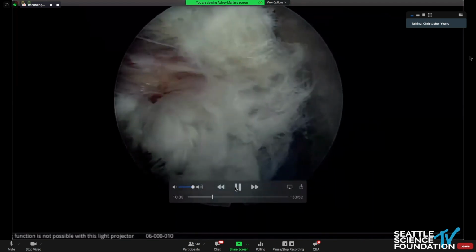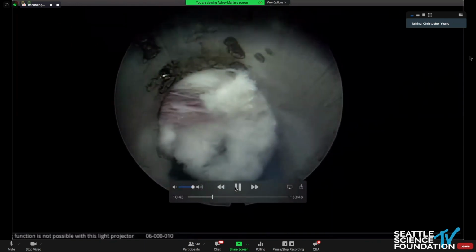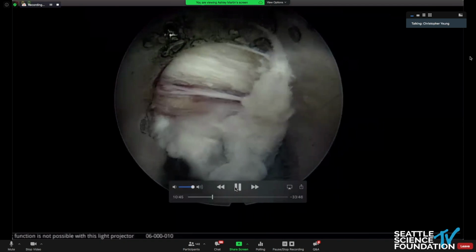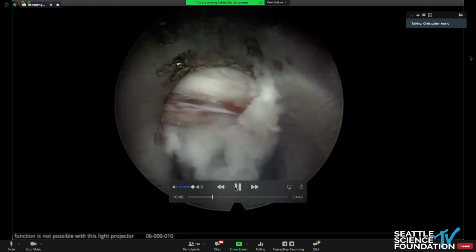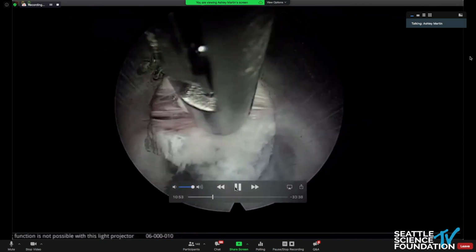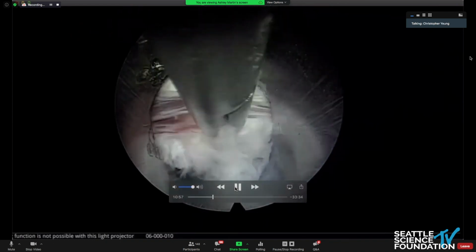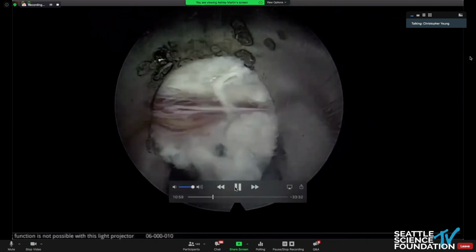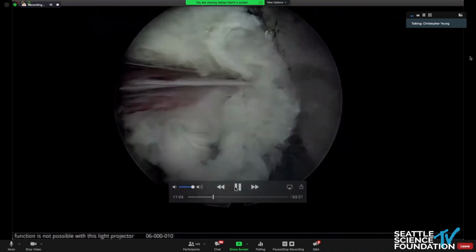It's important when your anesthesiologist is doing that not to totally knock the patient out with some propofol. We will just use fentanyl so that he's awake and aware. Grab this out of the way. If you retract the nerve too hard or grab the nerve, the patient will let you know. So that's your real-time nerve monitoring device.